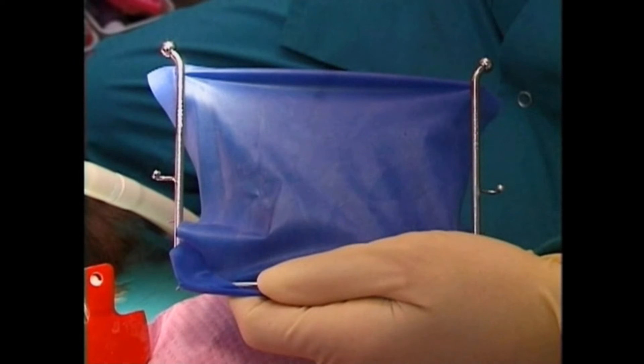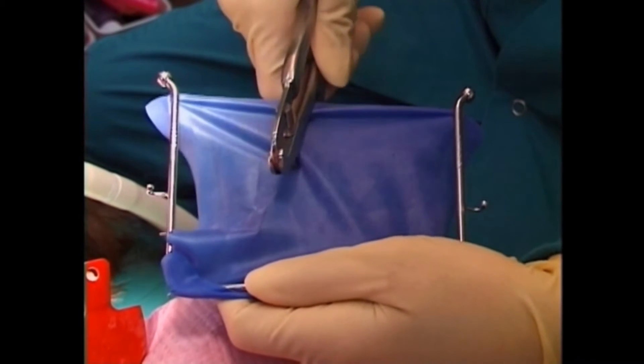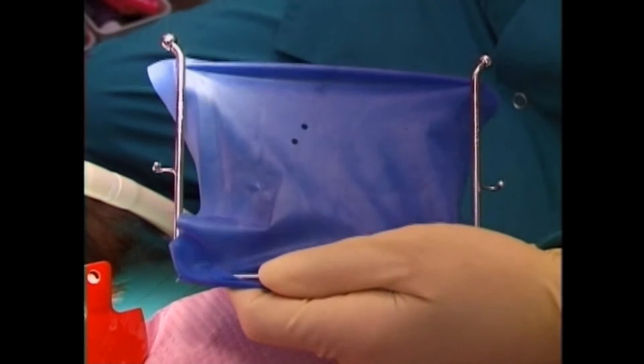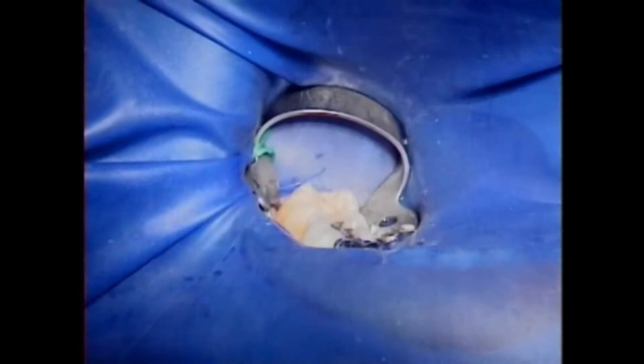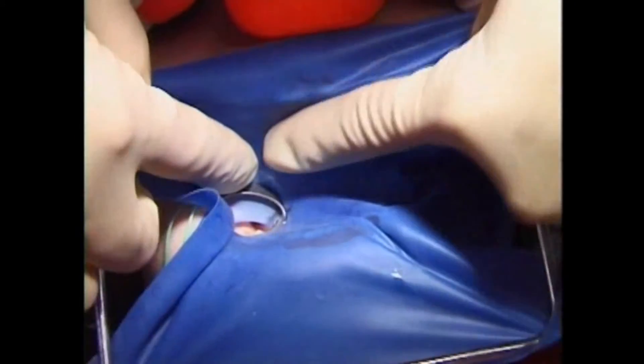It's called a rubber dam. This is a rubber dam. It's made out of stretchy, rubbery material. To put a rubber dam on your tooth, we first put holes in it that match the teeth we're going to work on. Then we put a special metal holder on your tooth. The rubber dam just slips on over the metal holder. We call it a dental clamp.